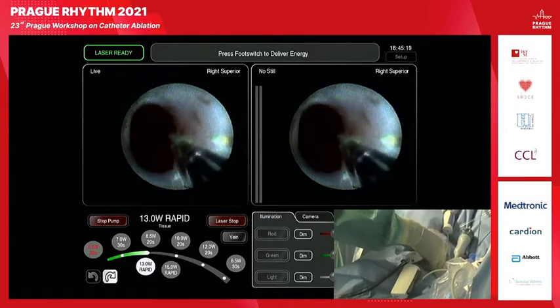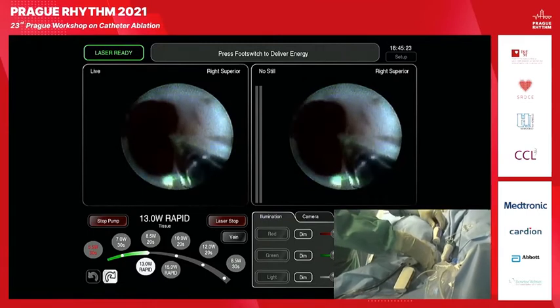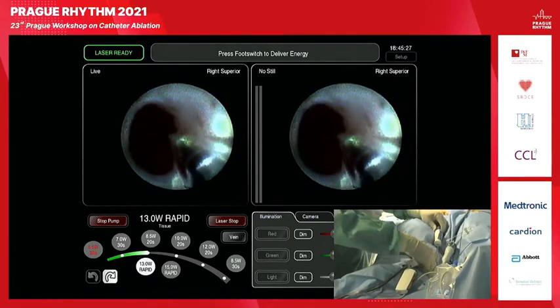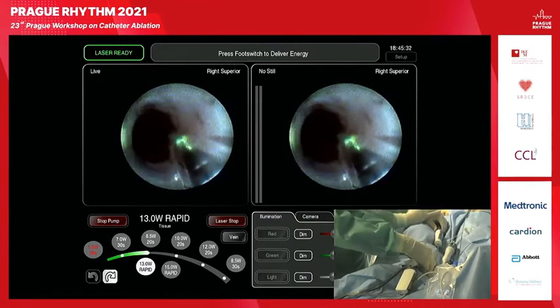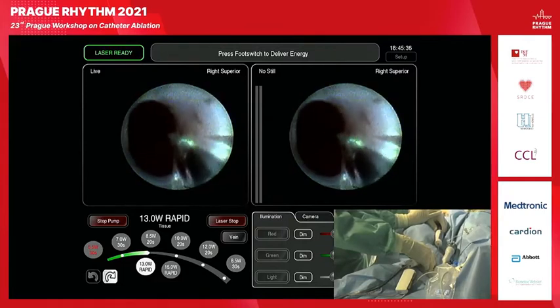We can adapt prior to the application. We can adapt the laser beam orientation if we want to apply really under the shaft. So I rotate manually with the button. I did a manual rotation, and I will show you that all the circumferential is easy to apply.